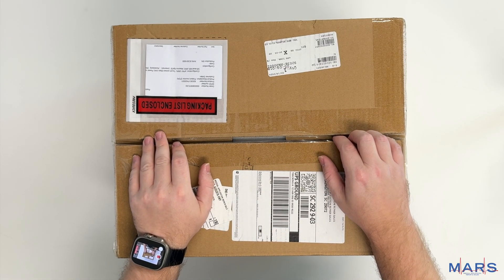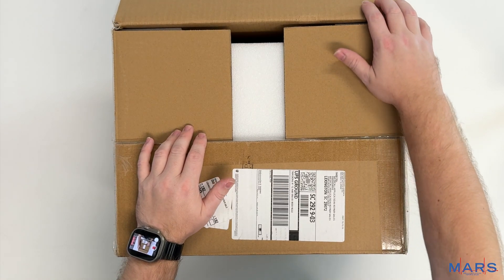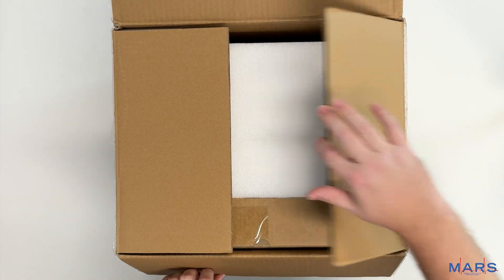We are going to unbox the Mindray EPM 12m slash 12ma patient monitor.